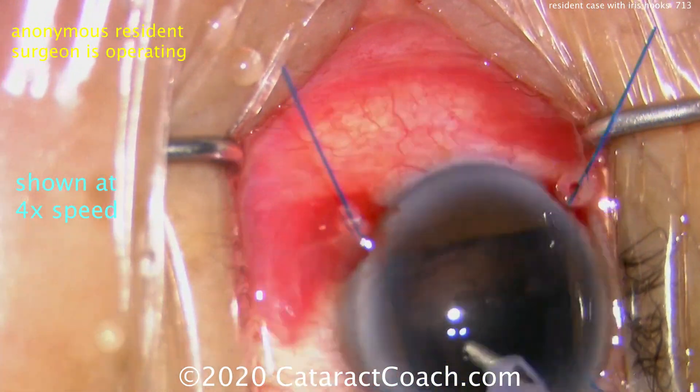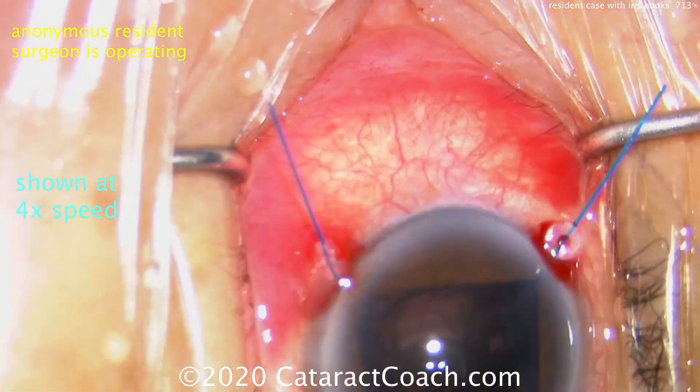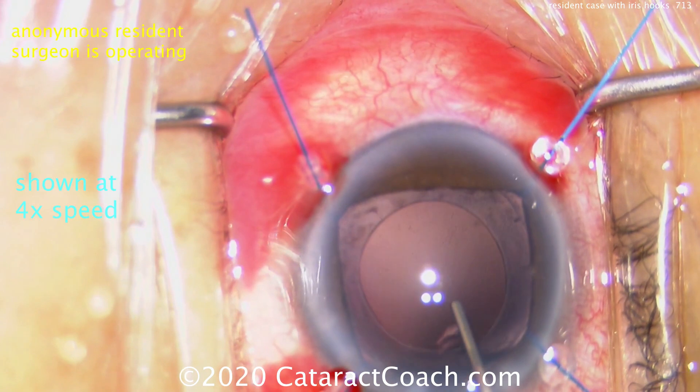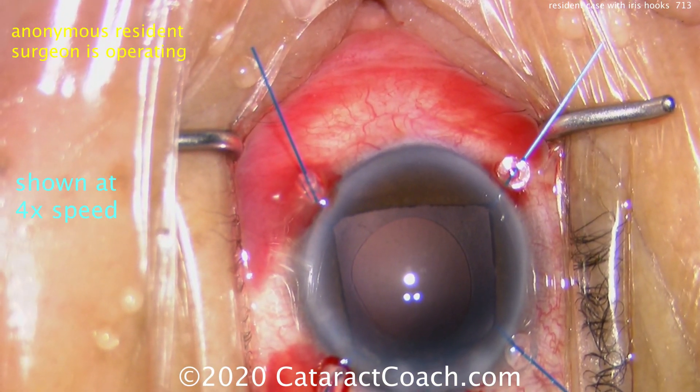It does take more time — this patient has five iris hooks in the eye. It's very important that you keep track of these and don't lose them. In some operating rooms, these are treated as if they're needles or other important devices, and if you lose them, you have to do a big hunt for them.